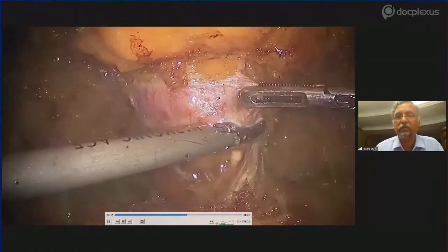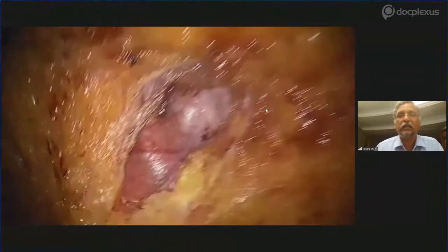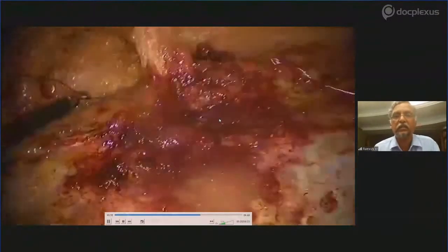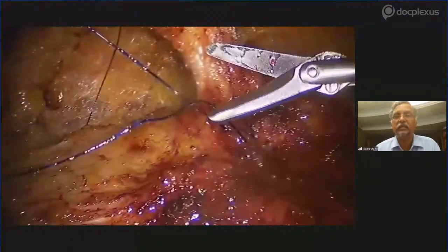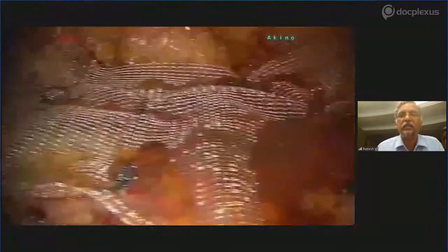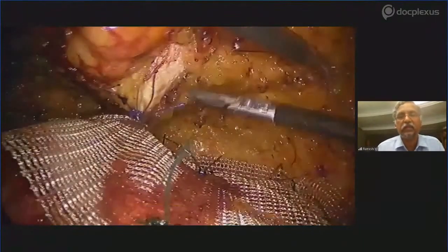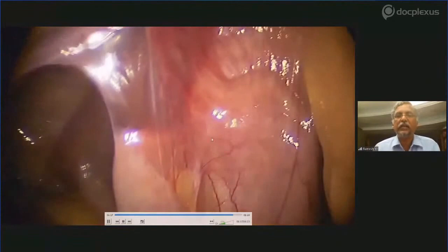As he showed, the steps are very easy and methodical, and it is very easy to do these surgeries for a primary ventral hernia of small size. As he showed, it is just like doing open surgery, quilting the mesh. The other thing that I have been doing is using a drain. The drains are kept through the two 5 mm ports.